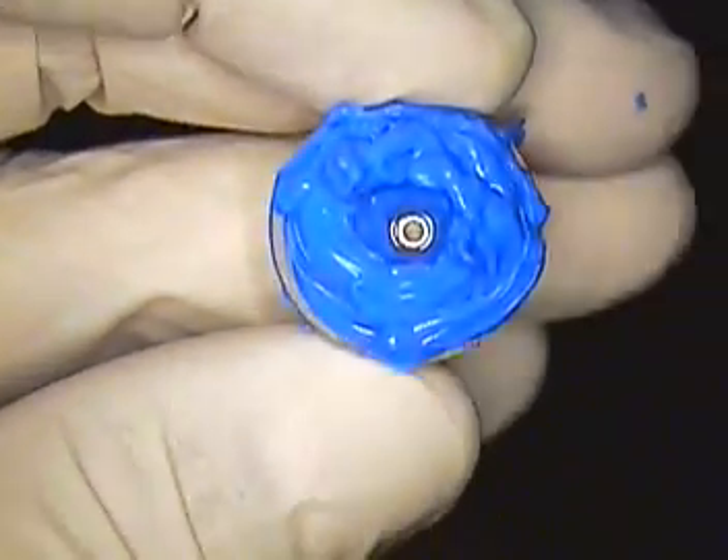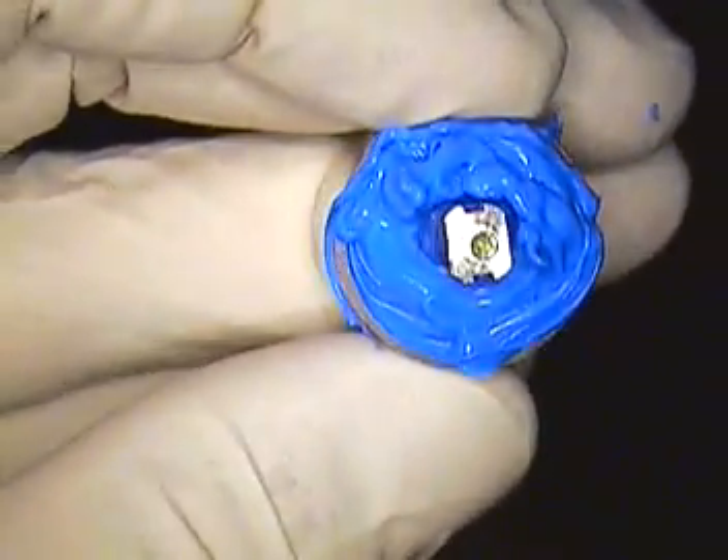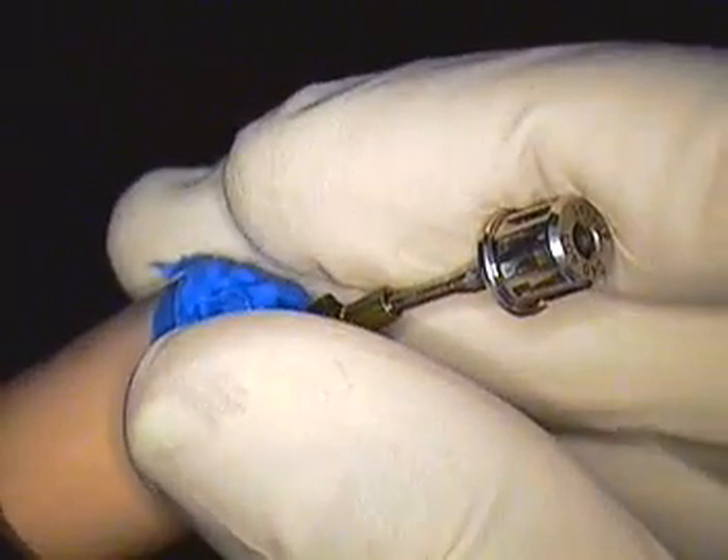Now imagine if this was without the blue material — you would just place that in there, like so. And you want the thin portion in the interproximal, so the thinnest portion in between the teeth. Then hand-tighten it down to 15 or 16 newton centimeters.